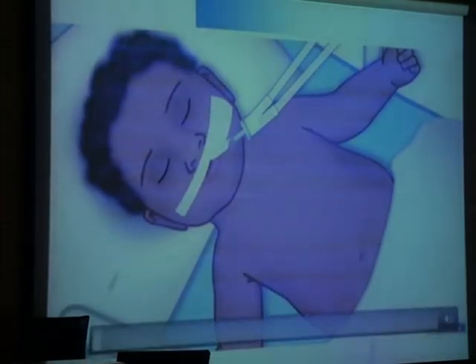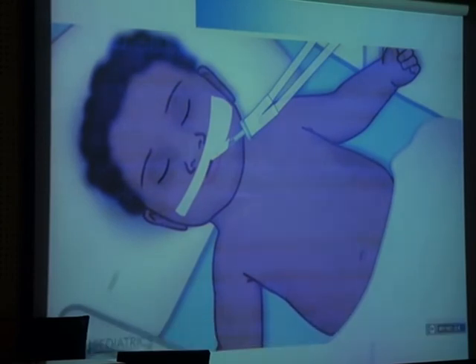This is the chest wiggle factor, as you can see here, and this is something that we often look at. You don't want to see the head moving, you don't want to see the arms flapping, those types of things. You probably have too much if that's occurring, and so it's something that you should think about.